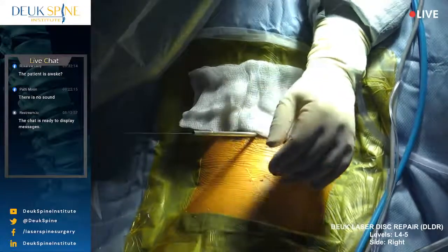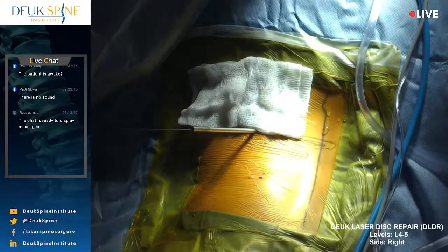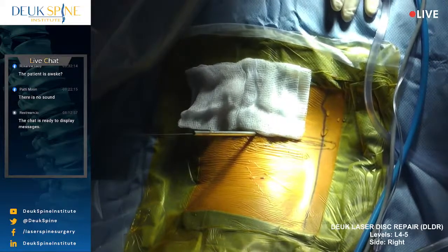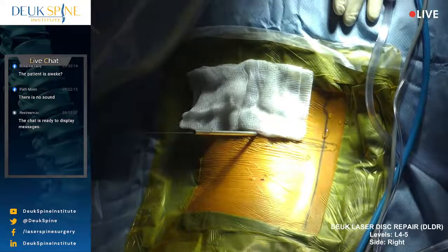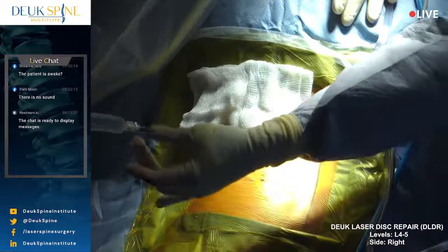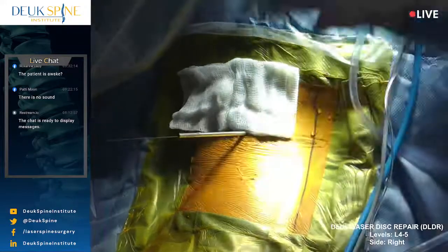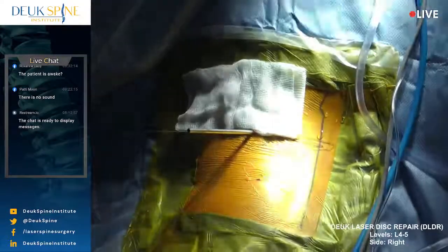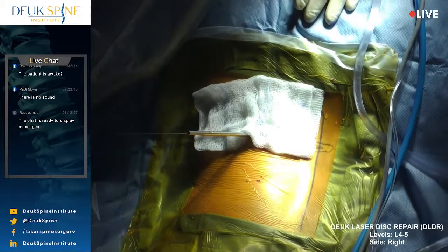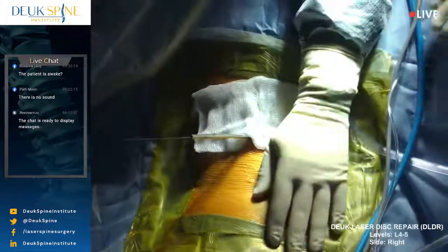Let's have some numbing medicine on a long needle. I'm going to give him a little local, see if that helps. Will that fit in here? Yeah, very good. All right. So there's actually a second port on this needle. I just gave him a little more numbing medicine. He's very sensitive to pain. Very, very sensitive. All right. Lay still. We need you to lay still.